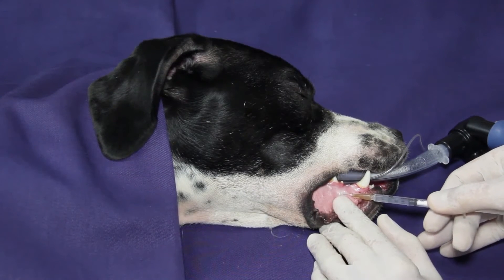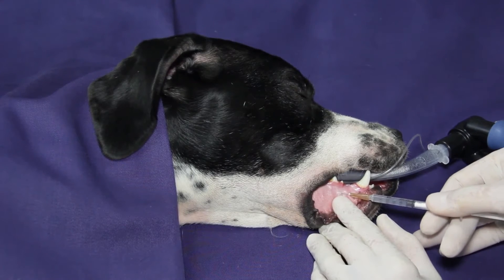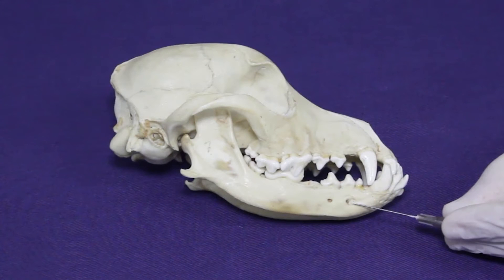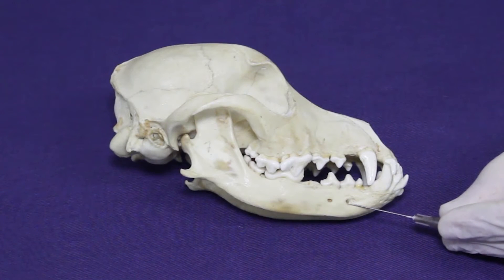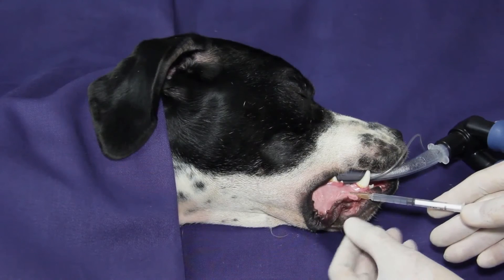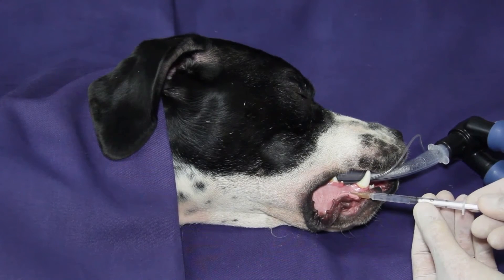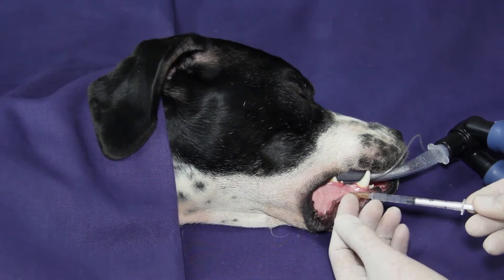Insertion of the needle into the mental foramen should only be performed in larger animals, since the risk of nerve injury is too high in smaller animals. As can be seen here, the mental foramen is the largest and easiest to insert a needle. When local anesthetic is injected at the entrance of the foramen, it will produce only anesthesia to the inferior lip and labial gingiva.